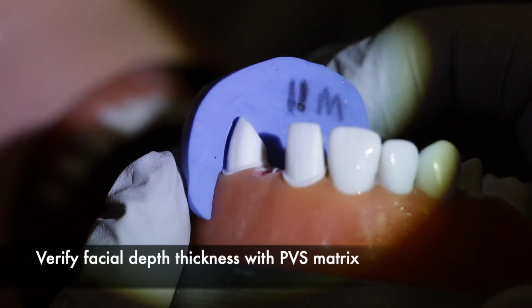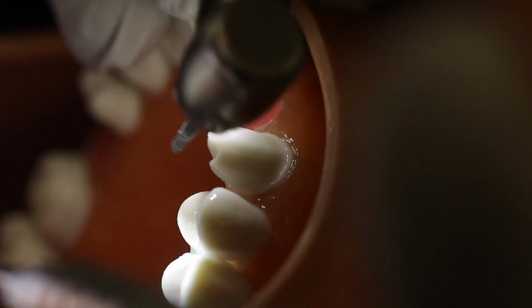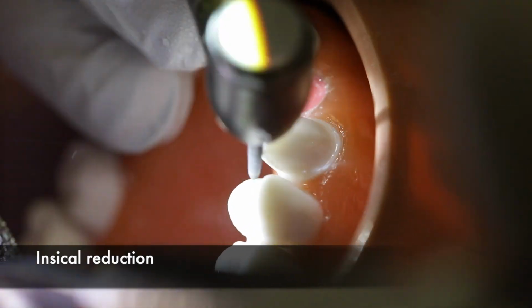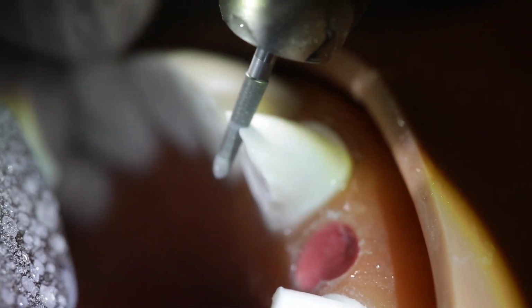Using a putty matrix, you're gonna verify the uniformity of your reduction on each abutment tooth. After this, I start with my incisal reduction. I make a depth groove on the incisal edge, and then I reduce the incisal edge to the depth that I did with the depth cut.